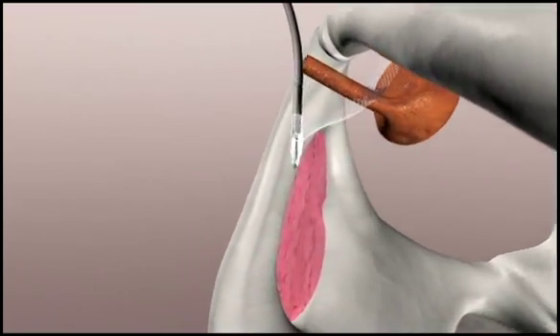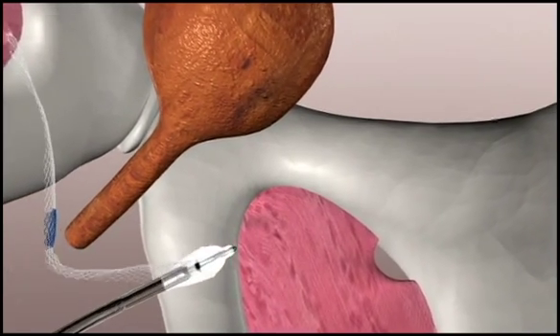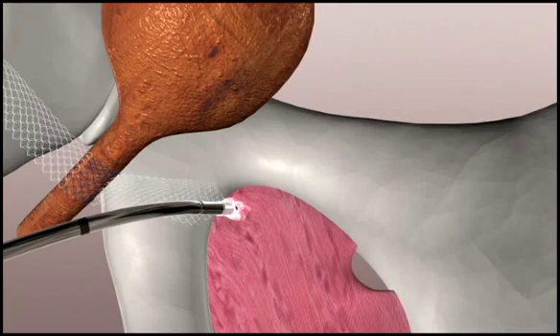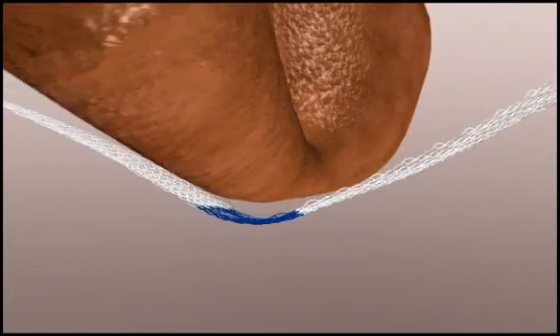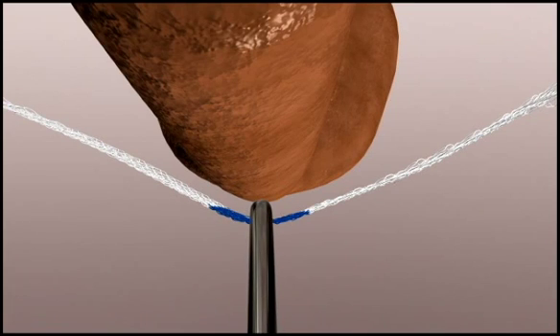In order to achieve proper sling tension, the sling should lie flat against the urethra. The sling is too loose if the mesh sags when pulled from behind, or if an instrument is easy to fit between the mesh and the urethra.